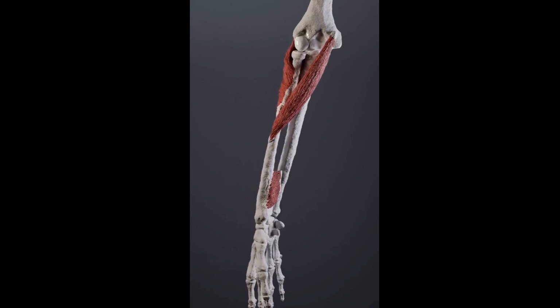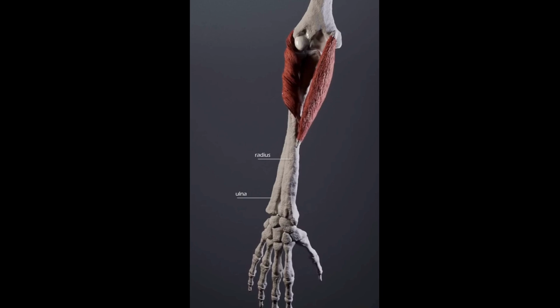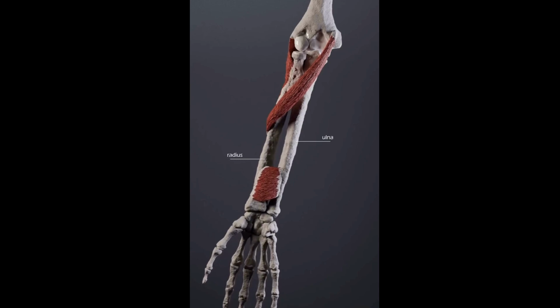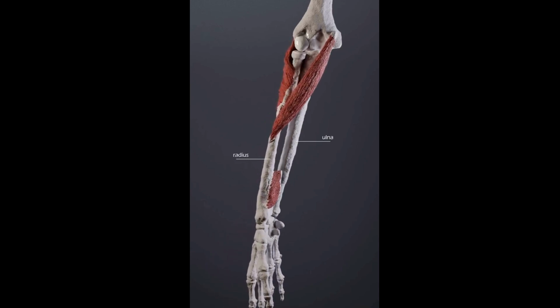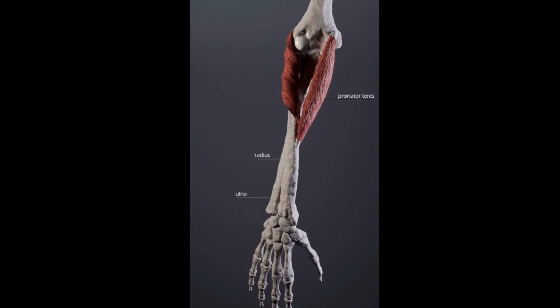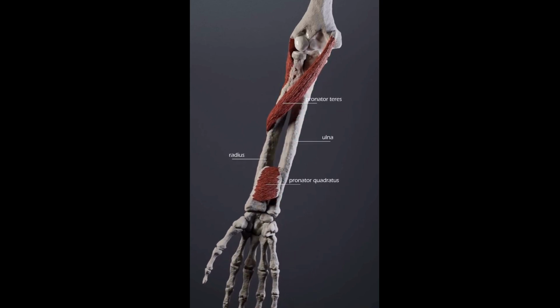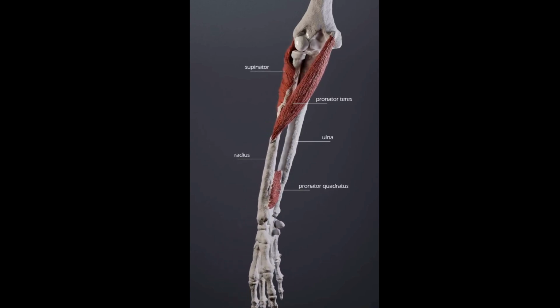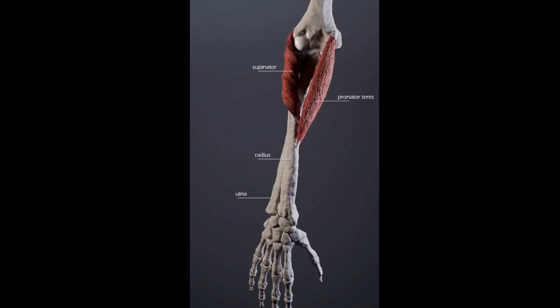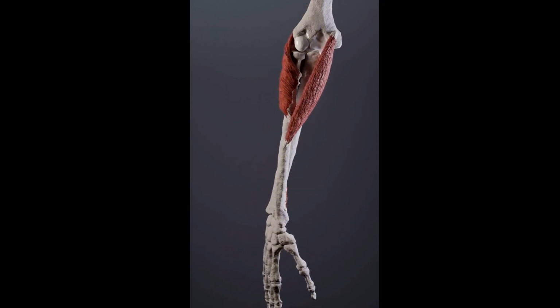Wrist pronation is the inward rotation of the forearm that turns the palm downward. This movement happens as the radius crosses over the ulna, mainly at the proximal and distal radio-ulnar joints. Two muscles, the pronator teres and pronator quadratus, work together to pull the radius over the ulna. To reverse this motion, the supinator muscle rotates the forearm back into a palm-up position. Now, let's go through how to measure wrist pronation.